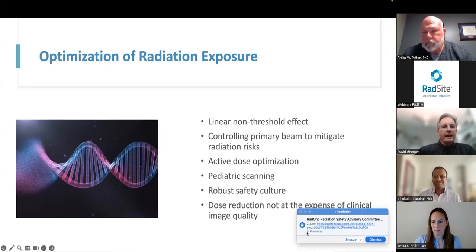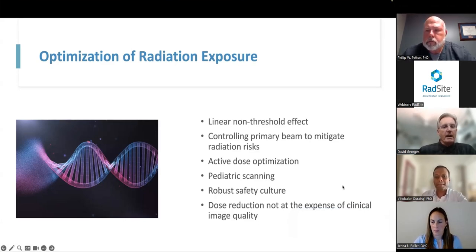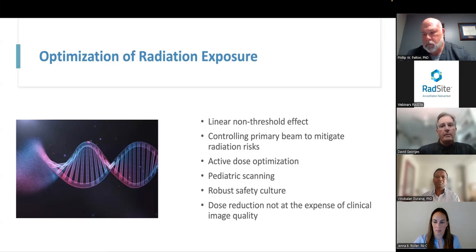Thank you. And I have to agree with Dr. Patton. This is an exciting time for X-ray emitting devices to see cone beam come into so many of the specific areas to image the body, save some dose, improve our image quality, have better safety. And in the case of breast CT, one other factor that should not be overlooked is that this is the first time that we can offer low dose imaging for breast cancer detection without the discomfort or pain from compression that is currently an absolute requirement in mammography machines. So I think that's going to help us with patient compliance and a number of other concerns within the medical community. So we're very excited about that.